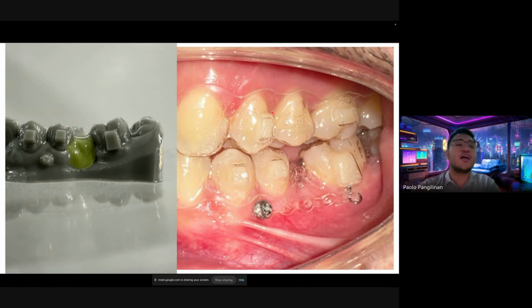Here's another thing that I love using. This is a model that I used for quite some time. My objective is to replace the sixes with the sevens and the eights. This is actually the mid stages of the treatment. And just to show you, we added an auxiliary called power arms and then attached it on the TAD, because this one delivers the right line of action.